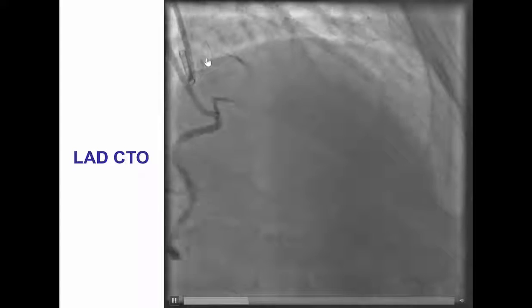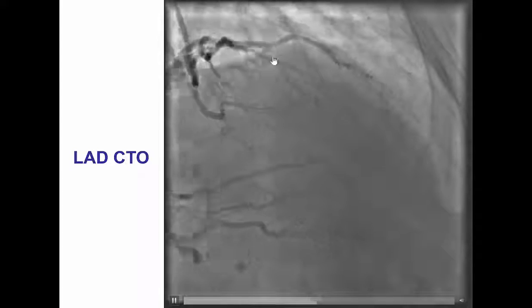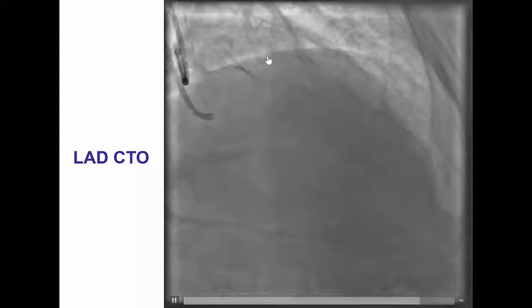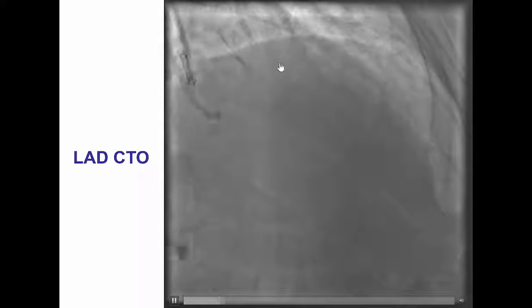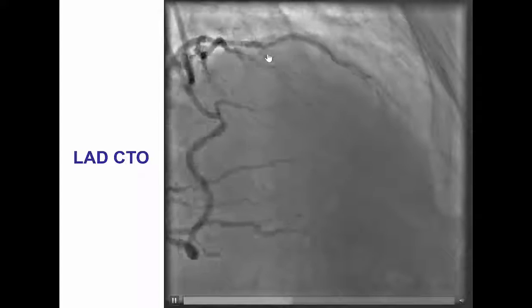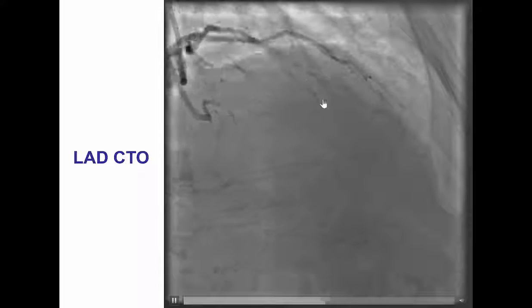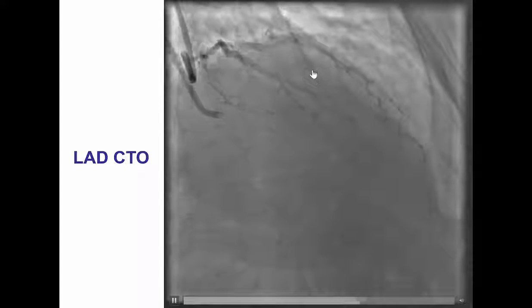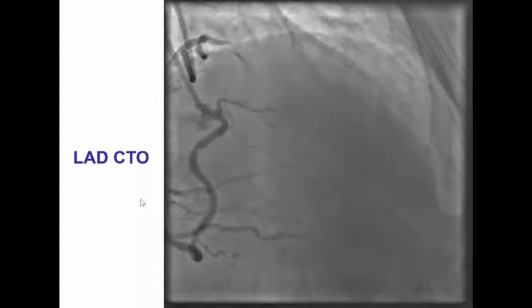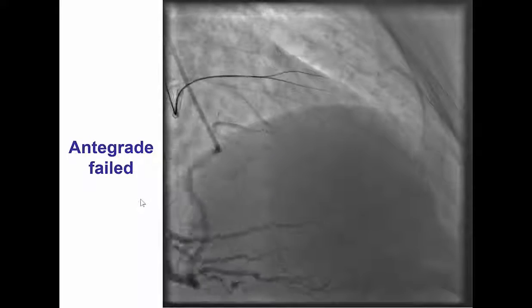The initial plan was to perform a brief antegrade attempt followed by retrograde crossing if the antegrade attempt failed. We did not want to do antegrade dissection re-entry because of the bifurcation on the distal cap, in an attempt to maintain patency of both branches of the distal bifurcation.